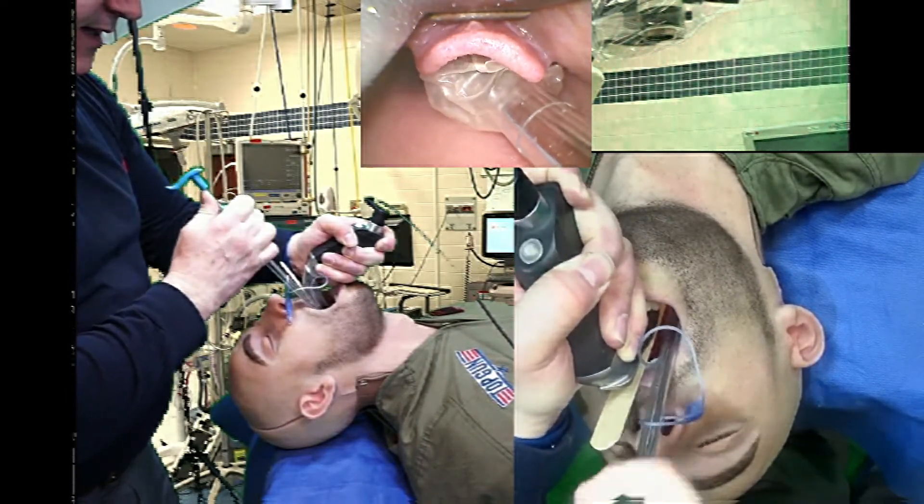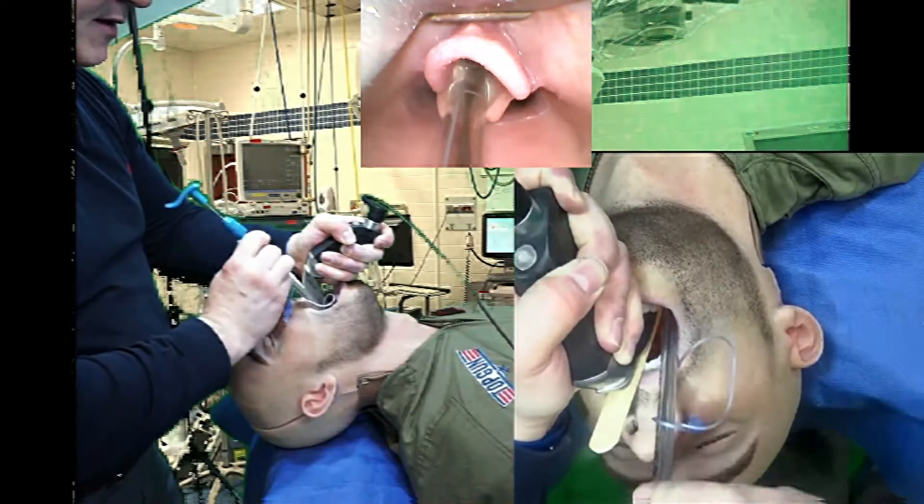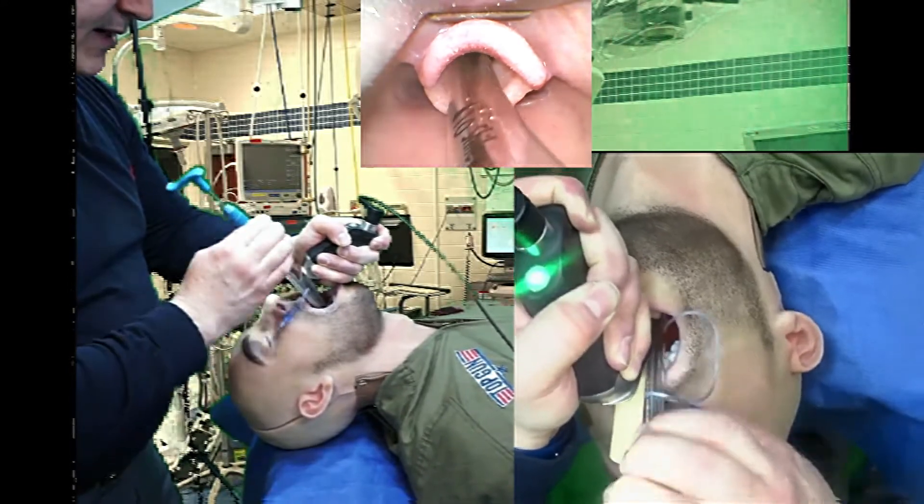I'm going to go ahead and remove my own stylet just by using my own thumb, because I am at the top of the stylet. I can remove, to a large degree, my own stylet.